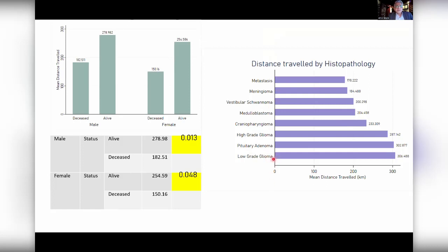So if you look at the low-grade gliomas and high-grade gliomas, this is the amount of distance that they are traveling. This is a huge amount of distance, and these are the ones that have to follow on a regular basis to see the patient, to get their MRI done, and then treatment adjusted. And this also affected their survival and all that. I'm not going to go into detail in that data, but that's all in that supplement.